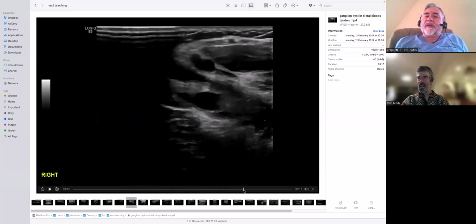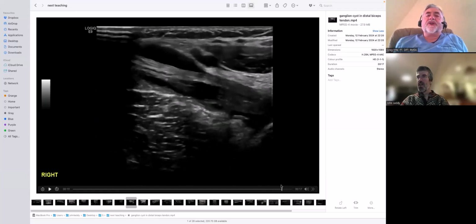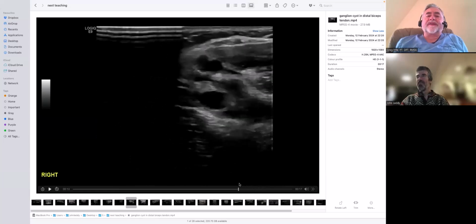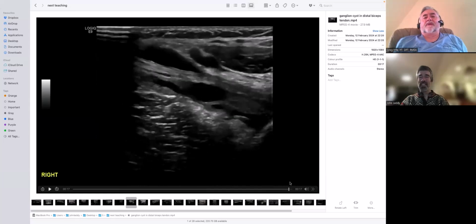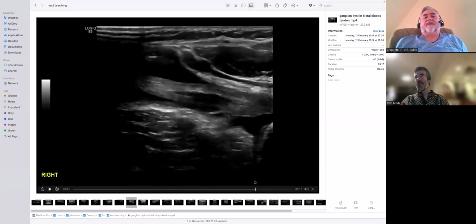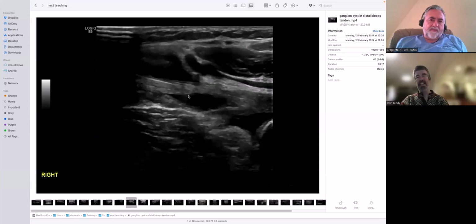Do you attribute the inflamed sheath, or the fluid in the sheath, to that irritability? Because we're long axis on it now, right? I don't know, is the short answer. The tendon will be abnormal, but it doesn't necessarily. We've seen problems in a wrist extensor tendon where one of those had a ganglion in it, where almost certainly what was happening is the ganglion was causing a stenosis as it shoved through the retinaculum.